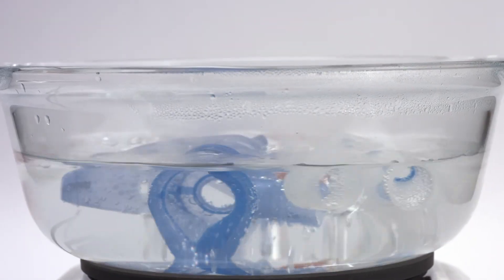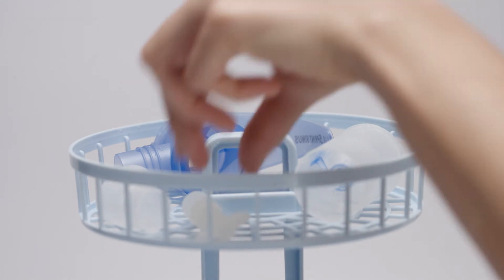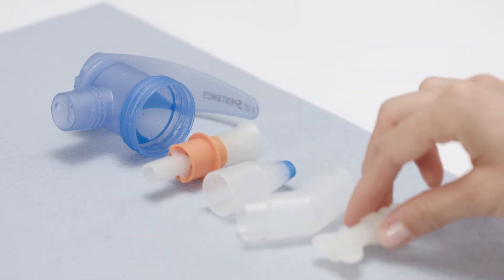Disinfect the nebulizer once a week for five minutes in boiling water, or in a standard commercial disinfector such as the one designed for baby bottles. Dry all components and store them in a dry, dust-free place.